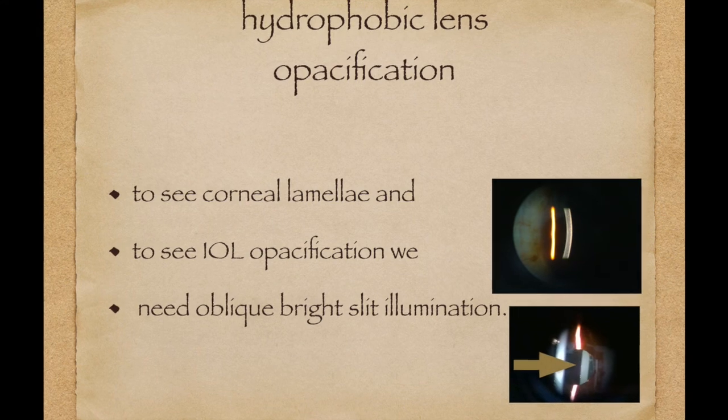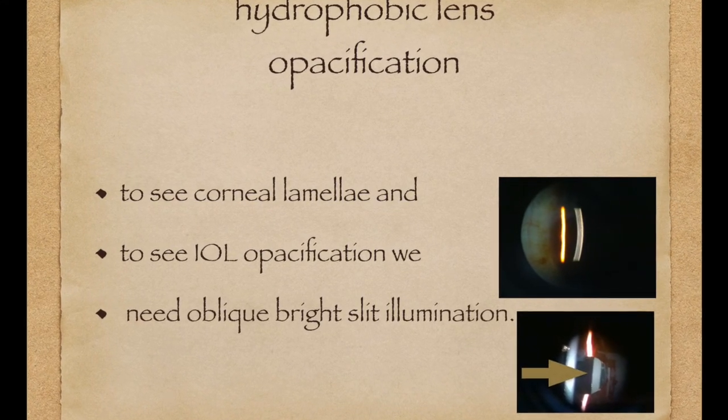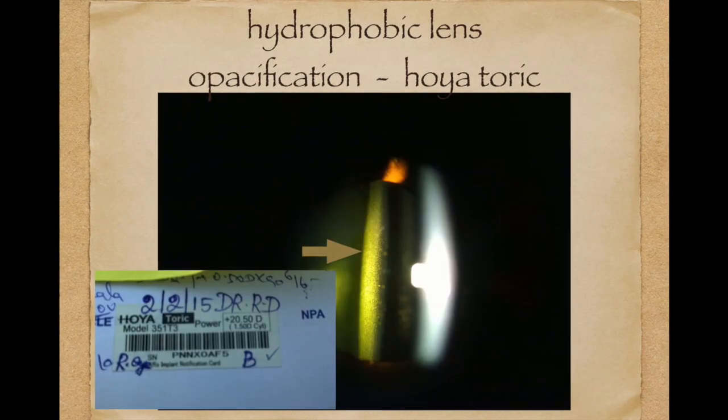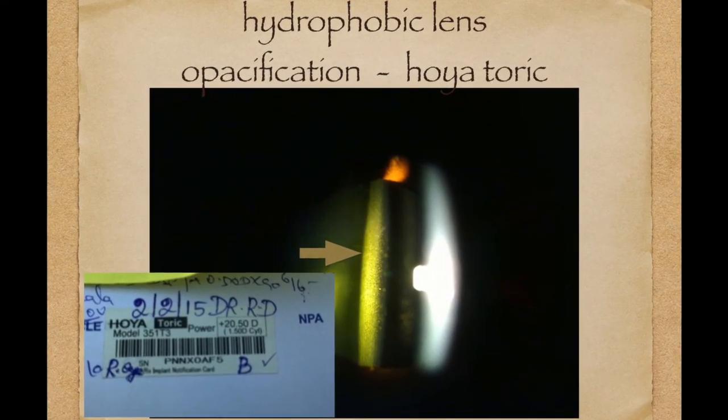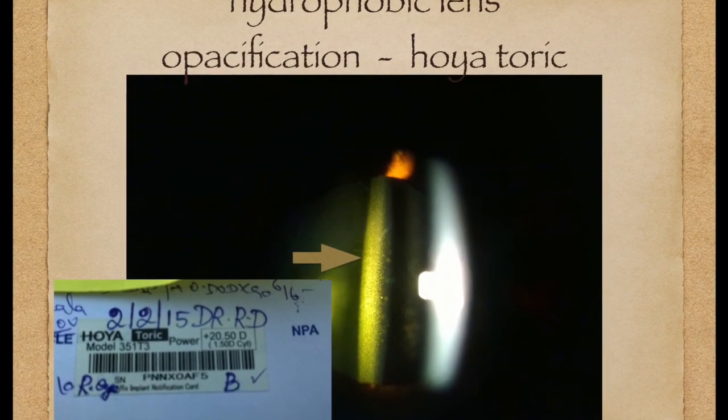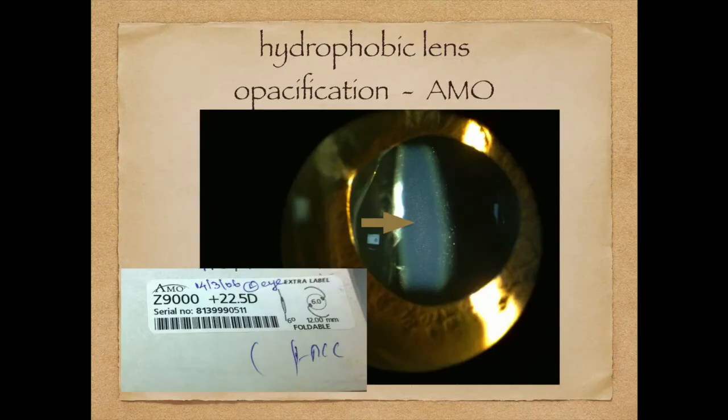To see these changes, we have to use an oblique beam with full illumination. Here we have an example of a Hoya lens implanted last year showing a remarkable amount of glistening. This is the AMO Tecnis lens implanted nearly 10 years ago showing fine glistening in the center of the lens and the diffuse change.